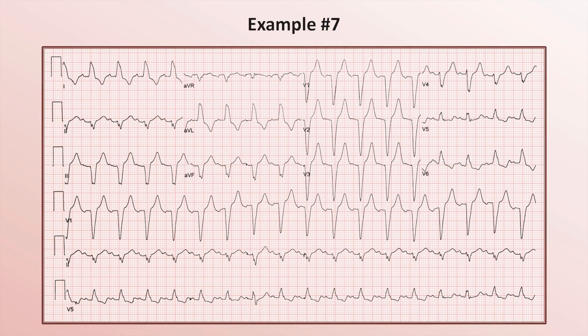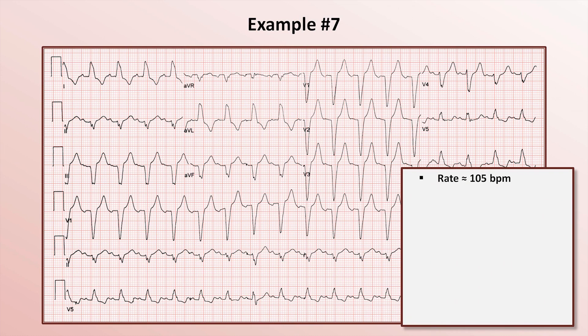Example 7. There are just under 3 large boxes between successive QRS complexes, so the rate is just over 100. There are 17.5 complexes across this strip, for a more precise rate estimate of 105.